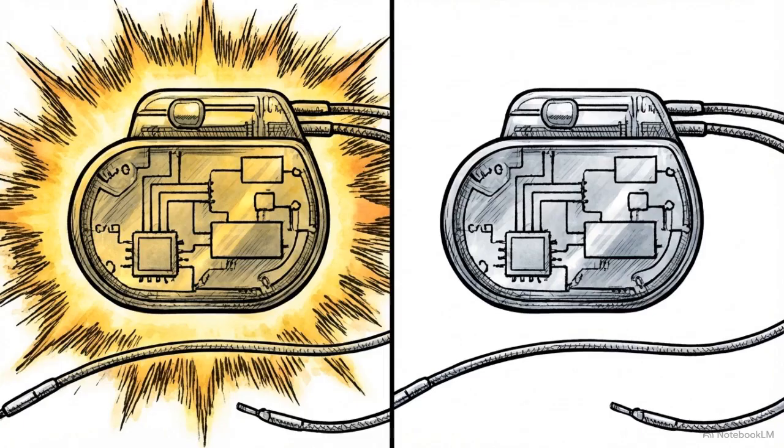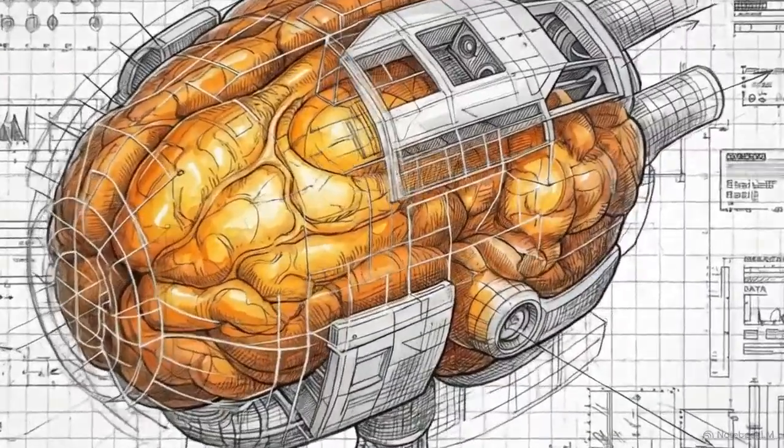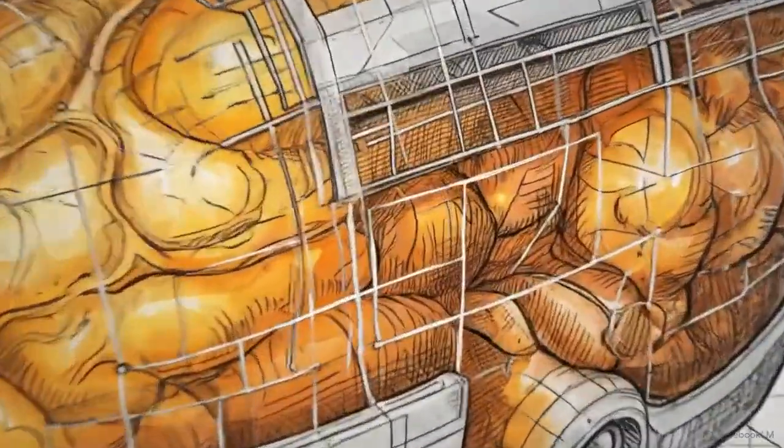The clinical protocol to avoid this specific artifact is rigid. Whenever you identify a highly suspicious hotspot, you must verify it against the raw, uncorrected source imagery. Relying exclusively on the corrected fusion imagery allows the machine's physics compensation algorithms to manufacture disease out of thin air.